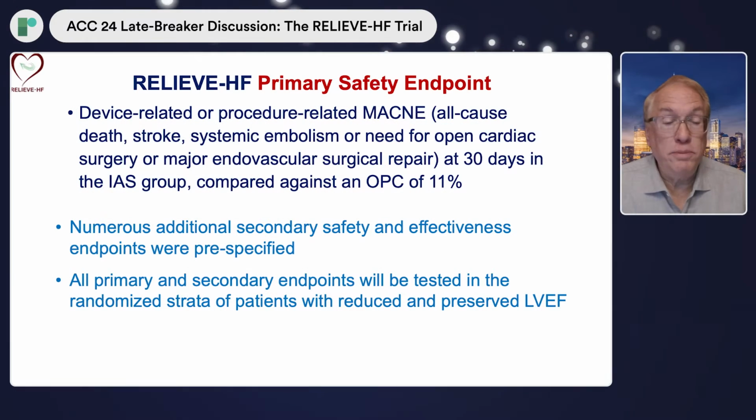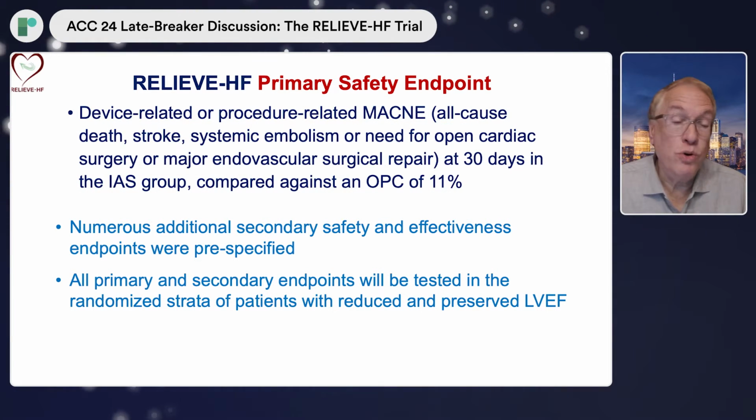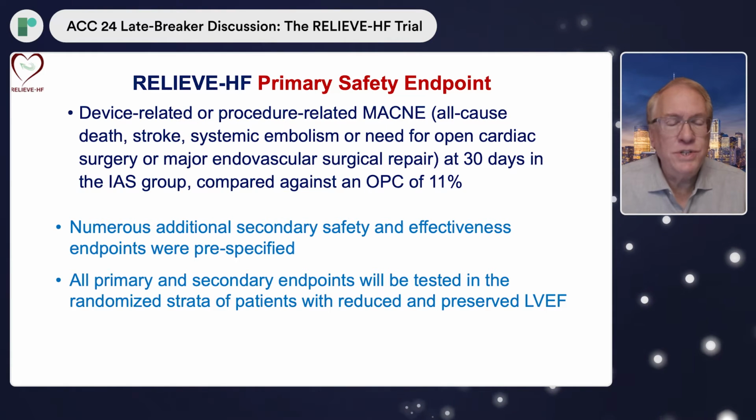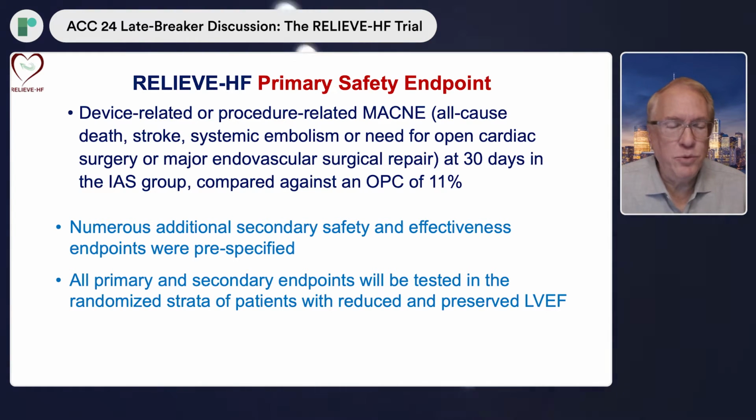I thought it was fantastic that you chose clinically relevant endpoints, certainly much more stringent than regulatory requirements for devices to get a pass. So tell us about your primary effectiveness endpoints. Right. Well, as you mentioned, we had two primary endpoints. One was safety. And we wanted to see that we weren't going to hurt people just through the procedure. So we had a primary endpoint, which is called MACNE, or Major Adverse Cardiovascular or Neurologic Events, which is a composite of adverse events related to the device or the procedure, just in the patients who received the device within 30 days. And that was tested against an objective performance criteria that we developed with the FDA.